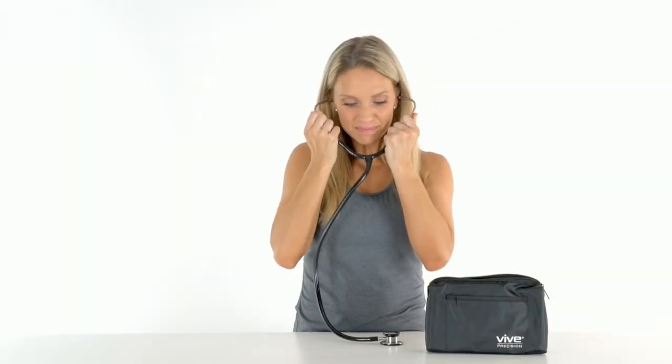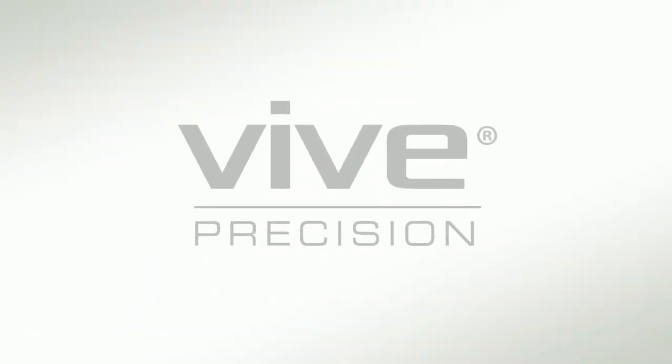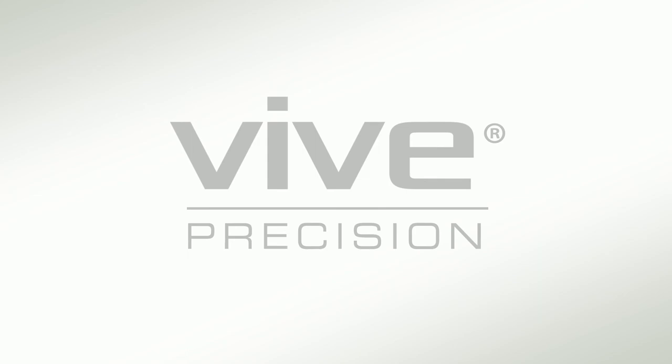So confidently order yours now for exceptional clarity and comfort. Vive Precision — accurate, user-friendly, health monitoring devices.